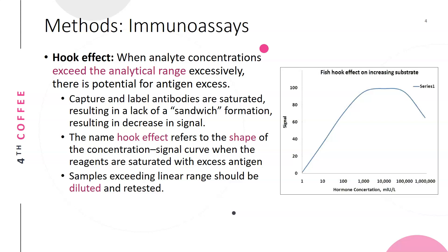With the hook effect, very high analyte levels can read low or even undetectable because the reaction cannot proceed. If you suspect a sample should be elevated, you should dilute it and rerun it. The name 'hook effect' comes from the shape of the concentration-signal curve — as you can see here, the signal goes up linearly, loses linearity, and then drops off, forming a fish-hook shape. Any samples that exceed the linear range should always be diluted and retested.